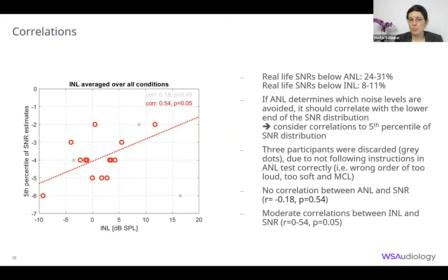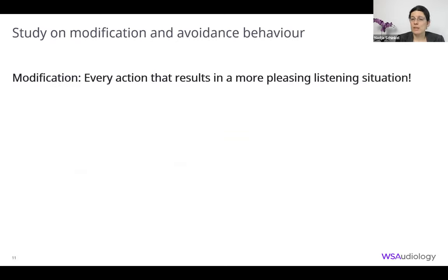But of course, it's not a proof. It could equally well be that what we experience day to day shapes our noise preference. For example, many people report that during the pandemic, they have not been in noisy situations very much. And as a result, they became more sensitive to noise. So we did another study where we really wanted to look at this modification behavior.